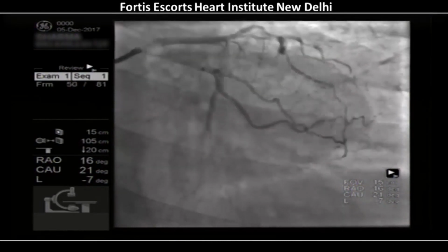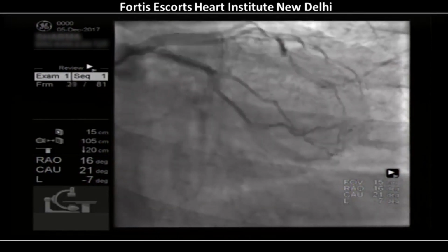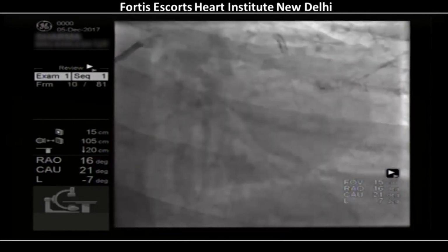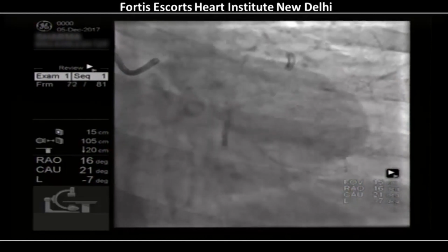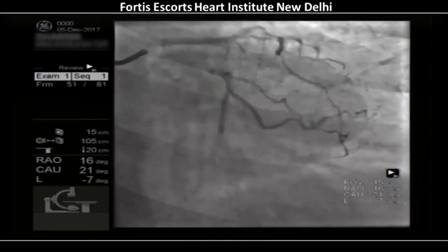All right, so let's take a poll. If this is the problem today, Mark, how do you deal with this? The patient comes back after a 2.0 stent in a distal circ, post dilated to 2.25, with symptoms. What do you do in this case?